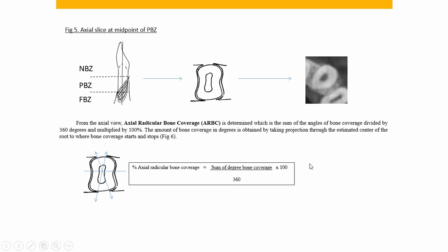Then we take the midpoint of the partial bone zone, take a slice through exactly the midpoint perpendicular to the long axis of the tooth, and measure the degrees of defect — the amount of the root circumference at that slice that's missing bone. You draw an angle from the defect edges to the center of the tooth, which gives you the degrees of defect. You subtract the degrees of defect from 360, divide by 360, and multiply by 100 percent, giving you the percentage of that root covered with bone at that particular slice.